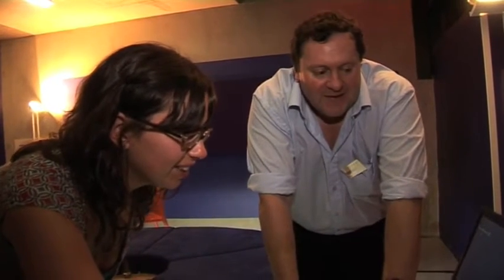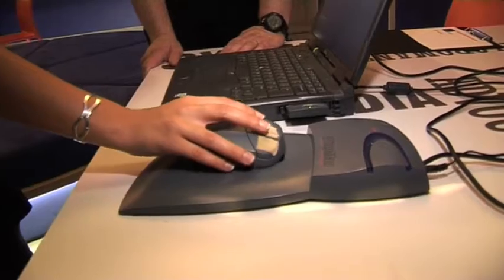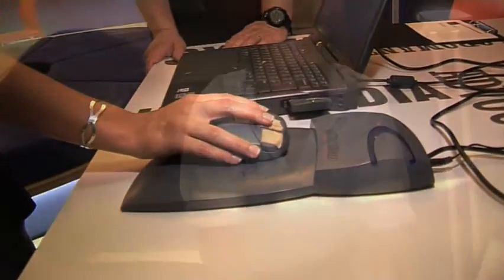Patrick Landon from the Cambridge Engineering Design Centre asks a volunteer to test out his system and explains how this assists people with motion impairment. So what it's like is like a ball on the end of a piece of elastic. And what's happening is that there are motors underneath there, and they're applying forces to the mouse that simulate the elastic. You can't lift it off, no, because it's being controlled by the motors underneath.